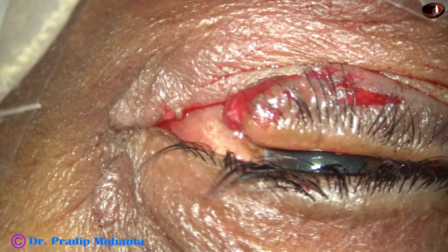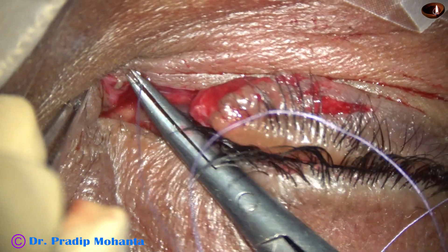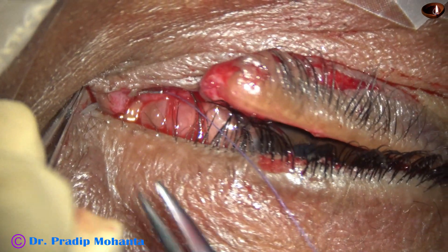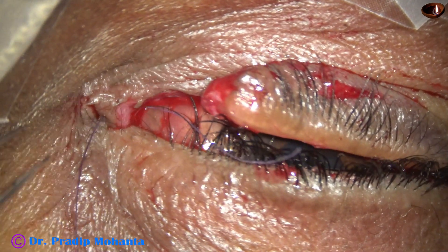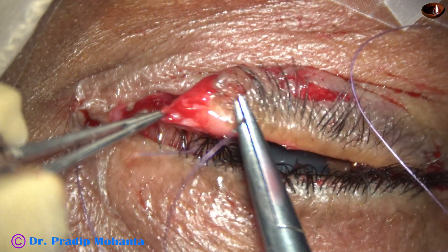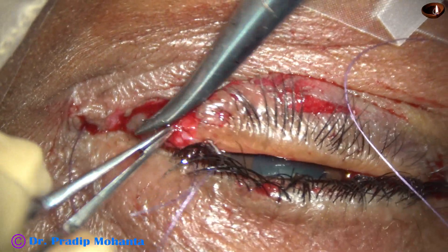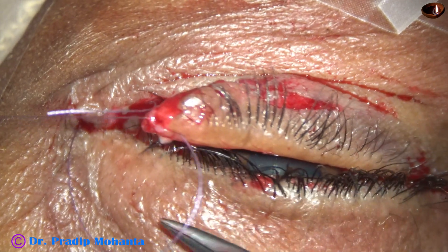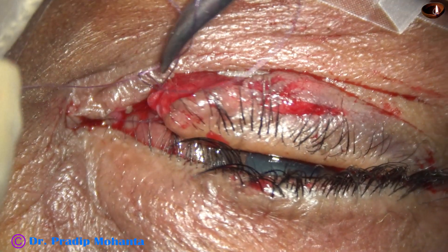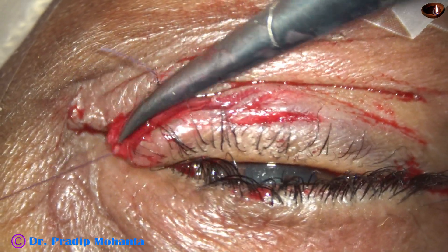So, we are going to lower magnification to get more field. After cleaning the area thoroughly, we take this bite where the knot will be buried in the tissue. First bite on the medial side, and then the bite is taken on the eyelid. This knot will oppose the eyelid to the medial canthus. And after that, we will take care of the rest of the injuries.